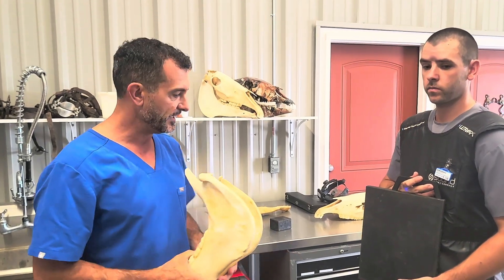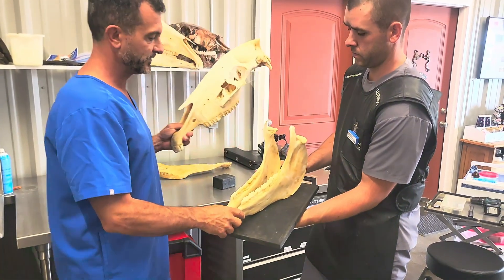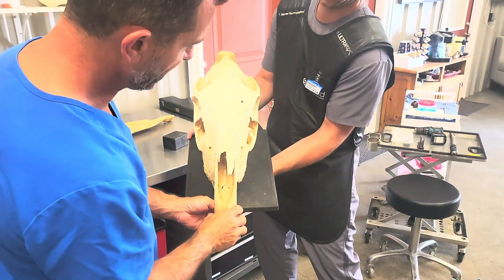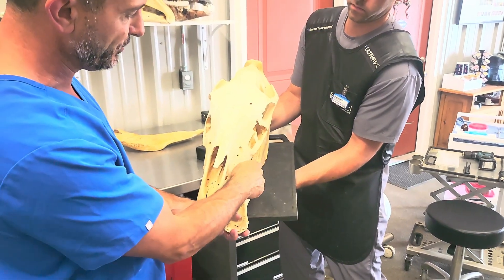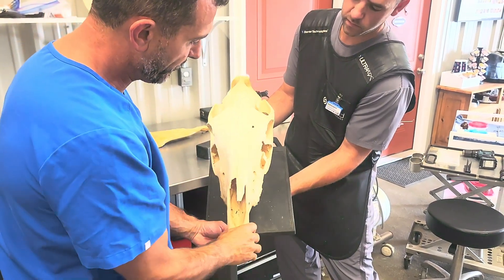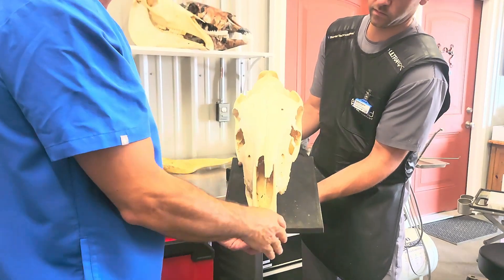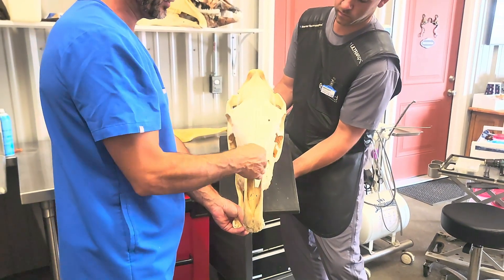There's another view called the offset dorsal view. Picture the skull — you're going to excurse the mandible out of the way. Sometimes if it's a six or seven you may be able to excurse the mandible and shoot straight down, but sometimes because the upper teeth are so wide you just have to excurse the mandible to the center and then shoot your beam down through there. That can be a helpful view when you're trying to look for distortions in a buccal-to-lingual direction.